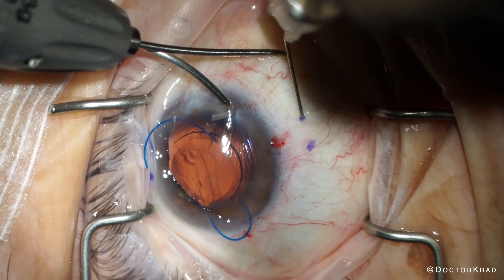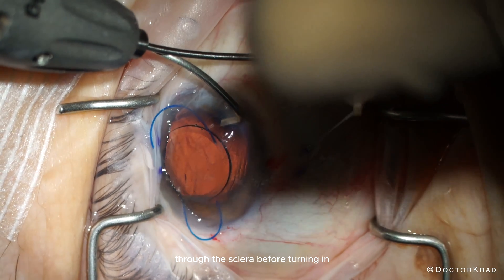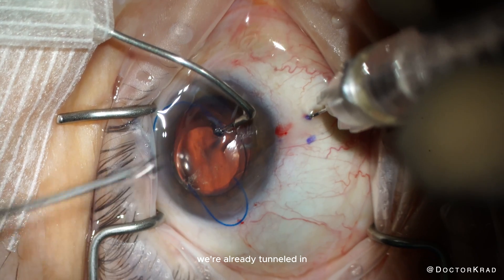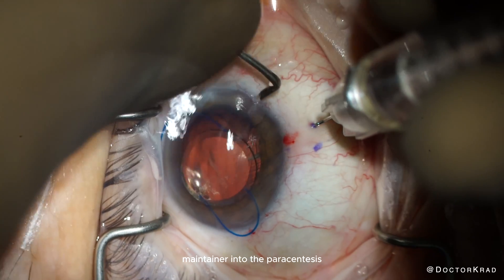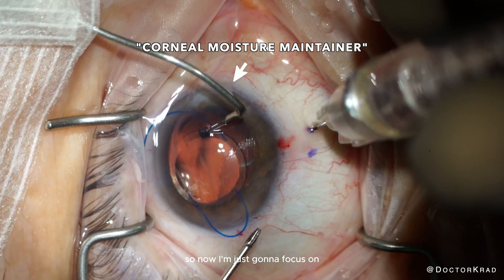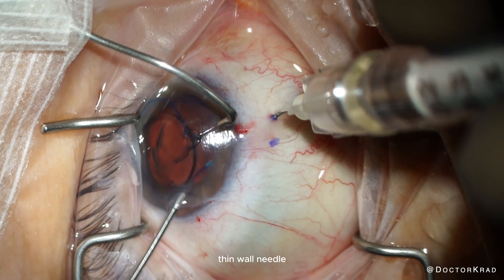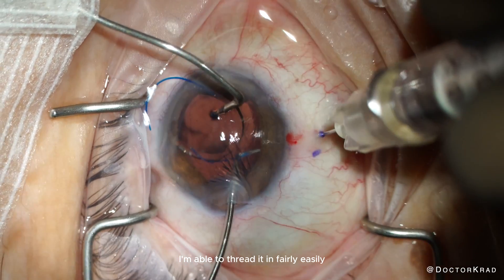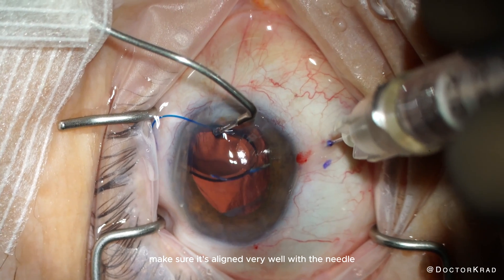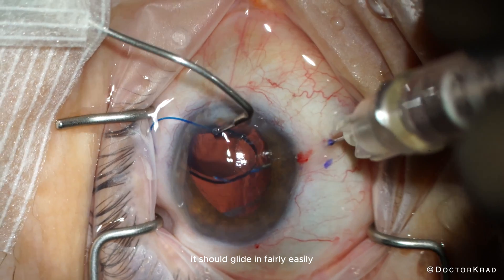I have a 30-gauge thin-walled needle, which I tunnel two millimeters through the sclera before turning in. My makeshift AC maintainer slides out, but fortunately we're already tunneled in. I attempt to reseat it into the paracentesis, but it slides right back out. So I focus on threading the trailing haptic into the 30-gauge thin-walled needle. I'm able to thread it fairly easily — when the angle of approach is not appropriate, you'll get a kink in the haptic. You shouldn't have to force the haptic into the needle; it should glide in fairly easily.